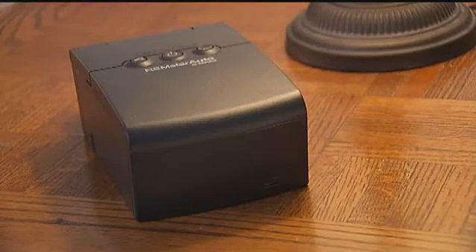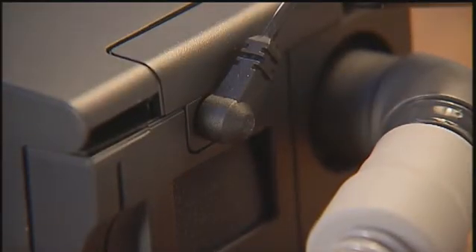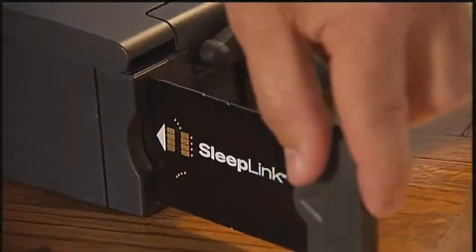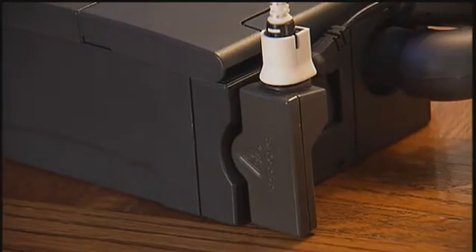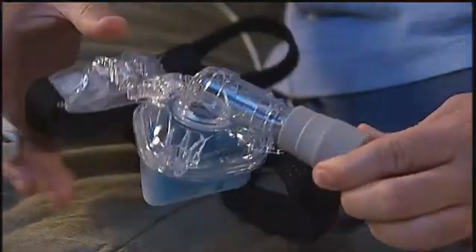If you have a Philips Respironics therapy device that looks like this, follow these instructions. Connect the tubing into the back of the device. Insert the black power cord into the port in the back of the device. Insert the sleep link card into the slit in the back of the device. Connect the flexible tubing from the device to the mask.